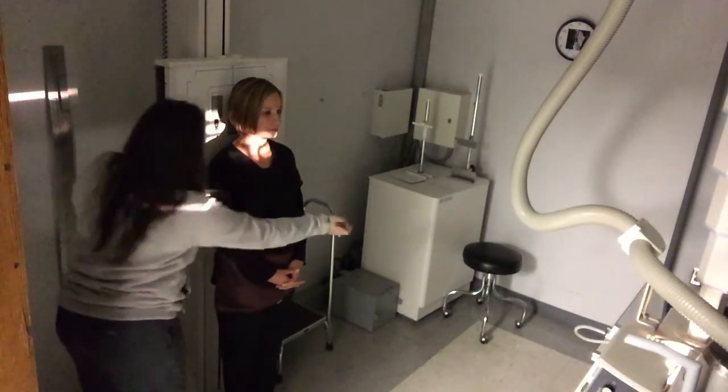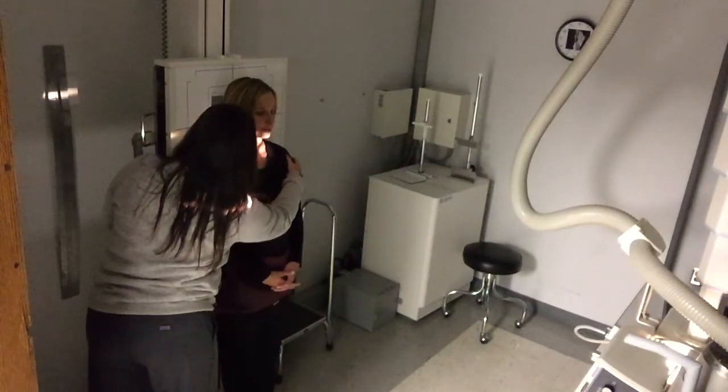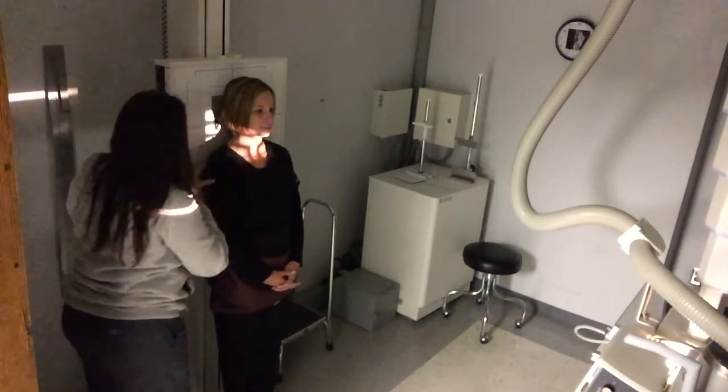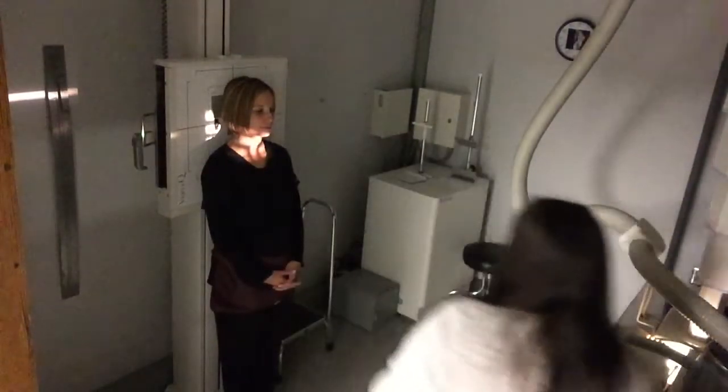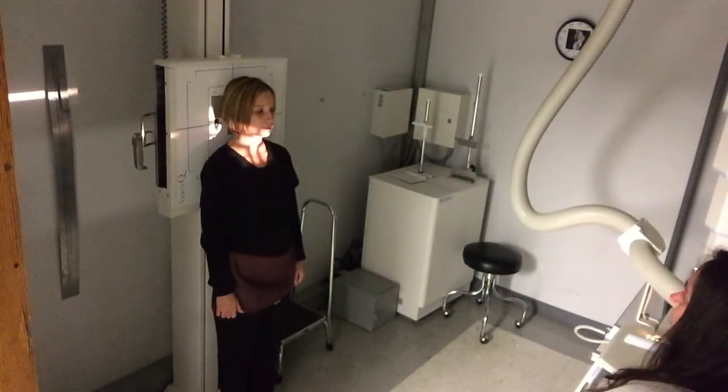Alright, so I'm lined up here, so I'm going to scoot her over just a little bit so that my central ray is right down the midline of her body. I'm leaving my right marker here. I'm going to collimate down a little bit closer to her side to side.